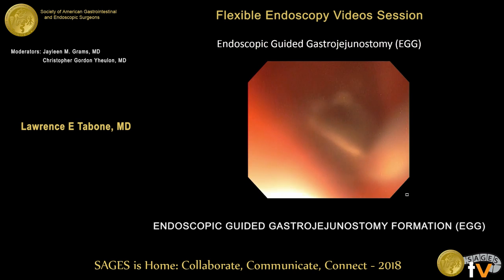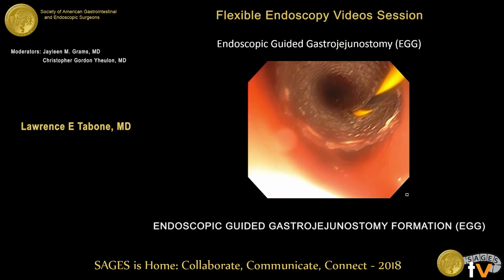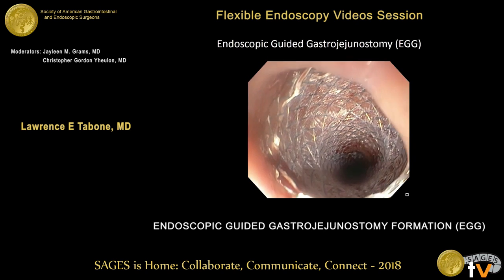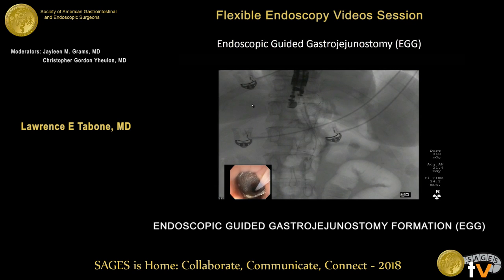This is the final deployment of the stent, and you can see the proximal flange completely opened up — this is a fully-covered stent. The wire was removed, and then we went back down with a tandem catheter to inject contrast through the stent to confirm that we had created a sealed anastomosis with no leak. You can see a pinch of the stent at the gastrojejunostomy, patency of the stent, and then the jejunum filling with contrast to show patency of the anastomosis.